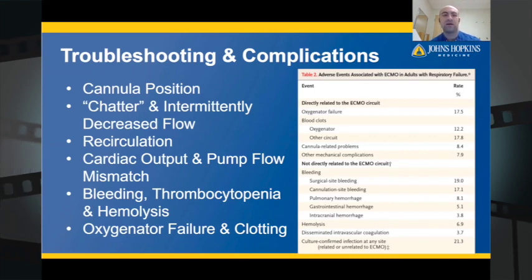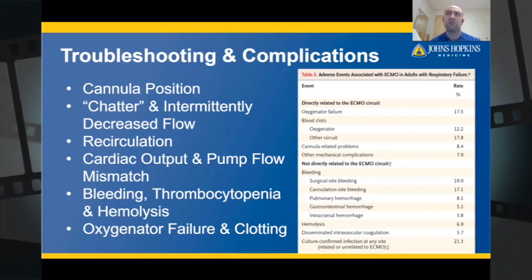The other thing is you can see when initially you have an ARDS patient, we tend to run these patients dry. But once they go on to the ECMO circuit, they may require some additional volume. When you see patients that are dry at baseline prior to going on to the ECMO circuit, you will often see something referred to as chatter, where the drainage cannula has intermittent flow due to collapse of the drainage cannula to the walls of the vessels, usually the IVC. This can be remedied by giving aliquots of fluid resuscitation or decreasing the pump speed. A reminder here is that speed is adjusted and flow is measured.